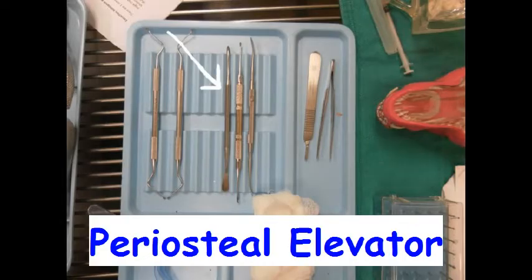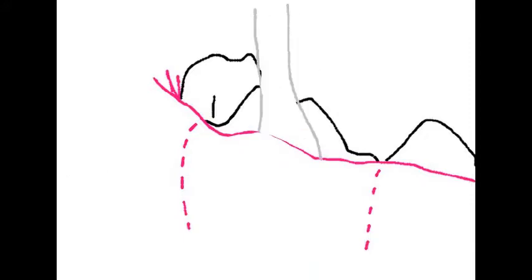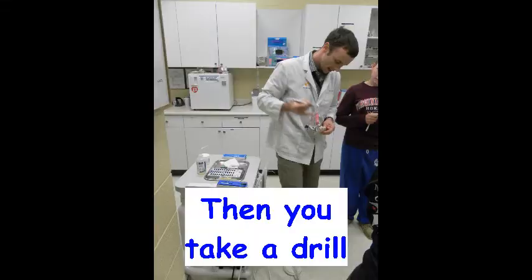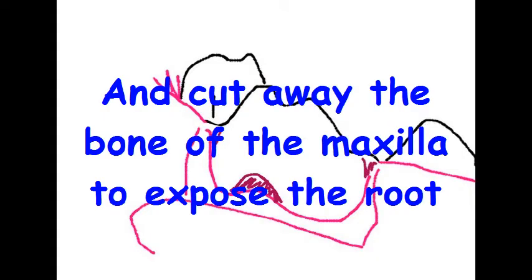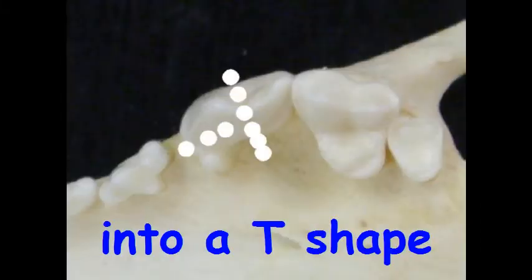Pick up your periosteal elevator and make this motion to expose the bone. Then take a drill and cut away the bone of the maxilla to expose the root. Then you section the tooth into a T-shape.